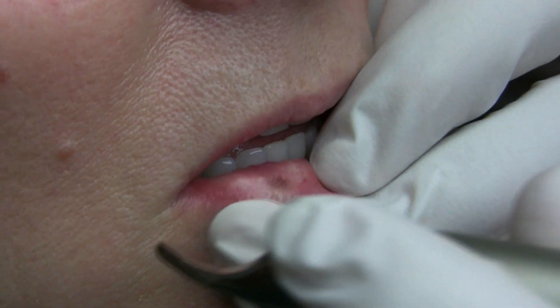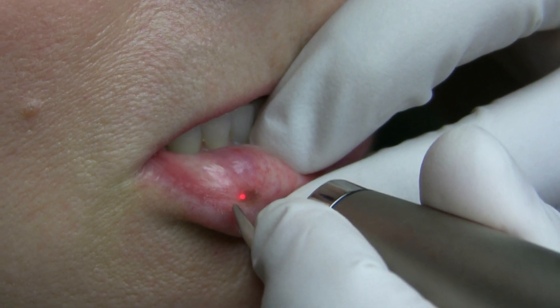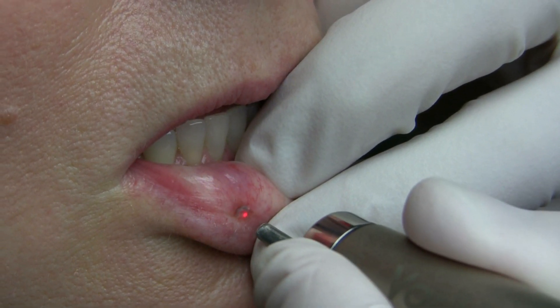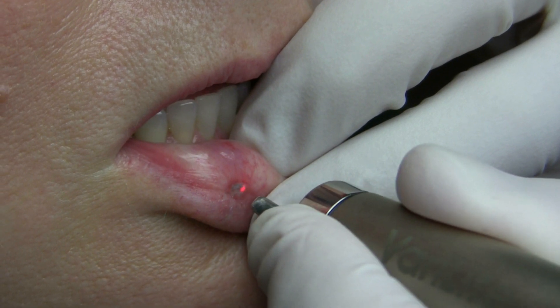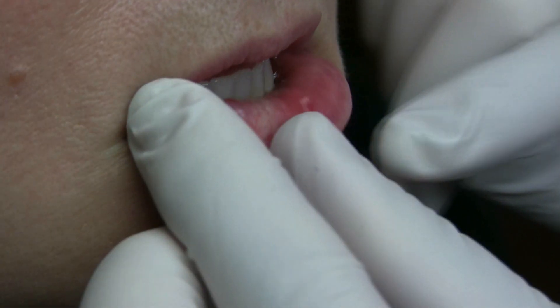We're treating this melanotic freckle with the 940 wavelength. We have 180 joules per centimeter squared. This wavelength has a high affinity for melanin. And that's it — we'll have the patient come back and hopefully that's gone.